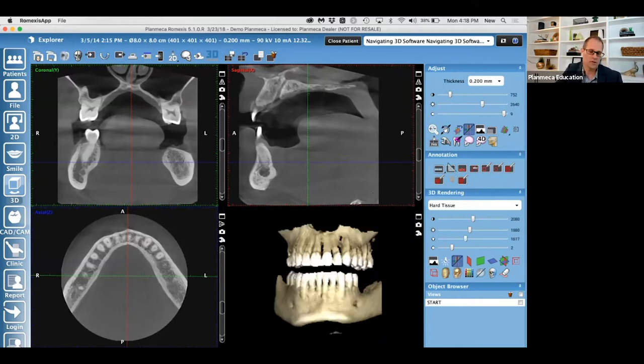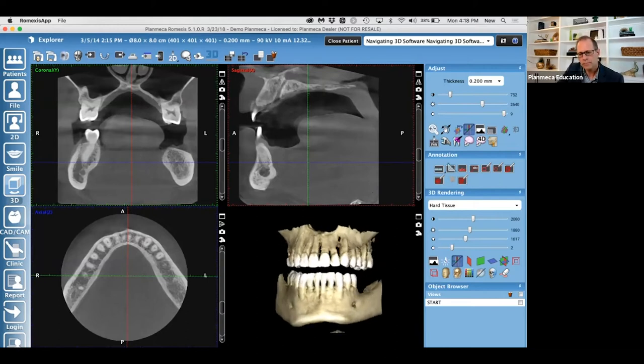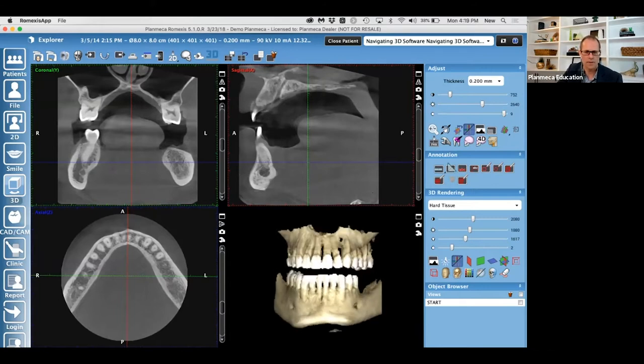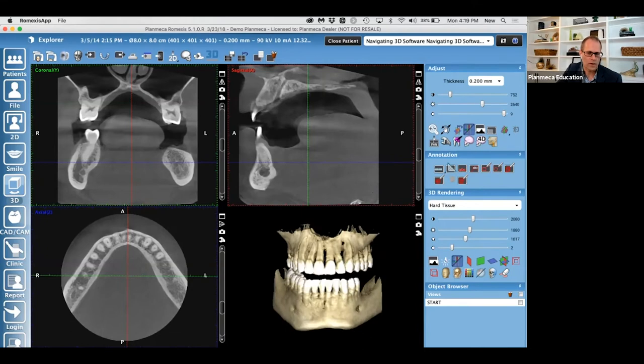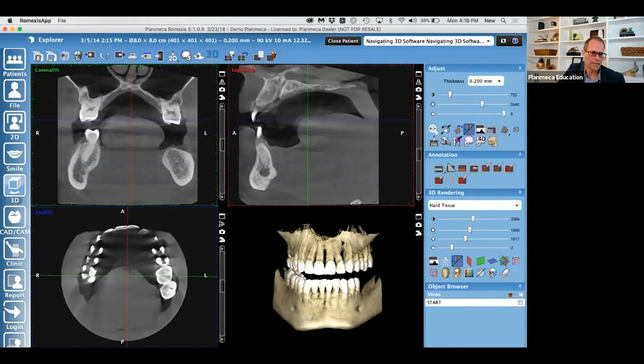Scatter radiation happens. Are there things you can do? Absolutely. So obviously radiologists and labs have talked about the puffer technique where a patient puffs up their cheeks. You can put cotton rolls in the vestibule to get the soft tissue away from the crown of the tooth, and that will help with scatter radiation. Once you get down in the bone level, scatter radiation is not happening at that point. But when you're at the crown level, that's typically where you see that sort of scatter.